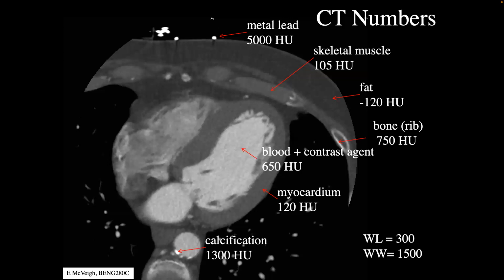It was injected into this patient's cubital vein, comes into their right heart, goes to their lungs, comes back to their left heart and into the left ventricle, then up the aorta and into the coronaries, right? And when it's in the coronaries, then it goes into the tissue, right? And so the tissue should rise. The Hounsfield unit should rise if flow is okay.